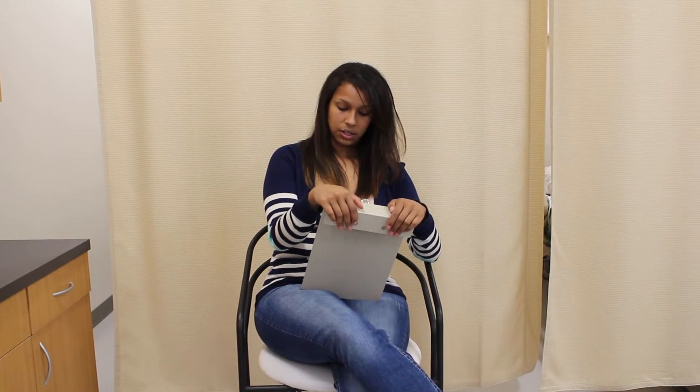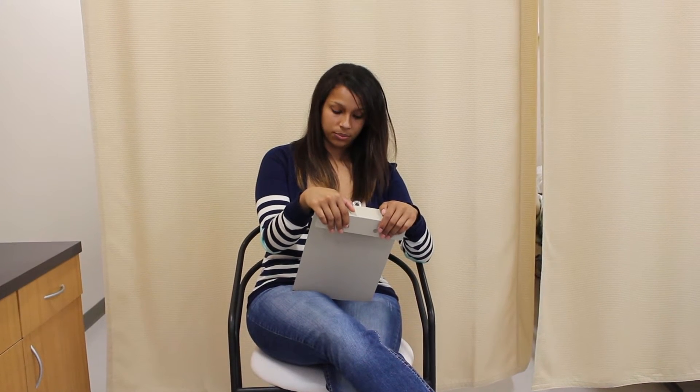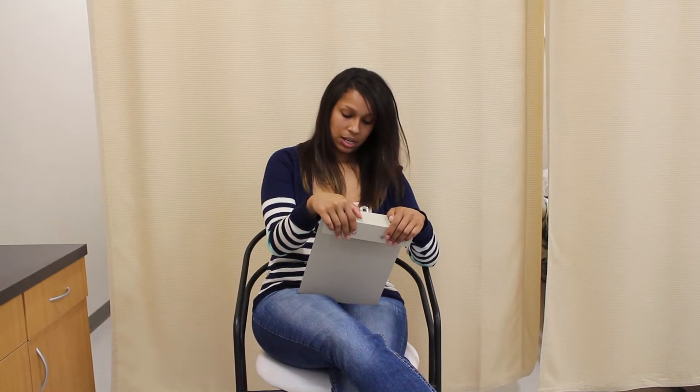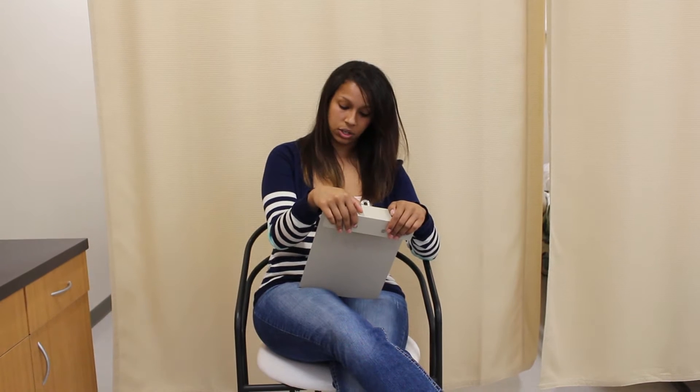The purpose of this video is to demonstrate the correct way to draw up and administer a subcutaneous heparin injection. This will be administered using the three checks and the six rights of medication administration. The scenario is that the patient was admitted into the hospital and the doctor has ordered heparin 5,000 units Q12 hours for DVT prophylaxis.